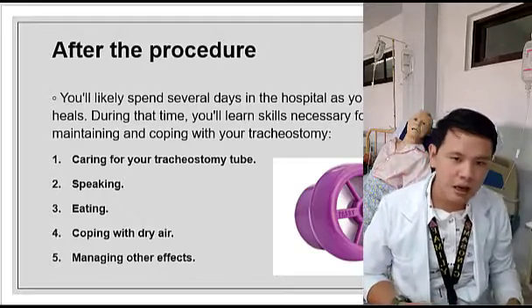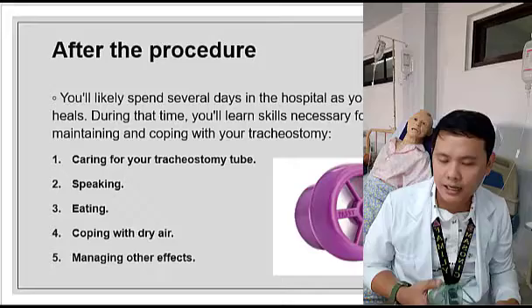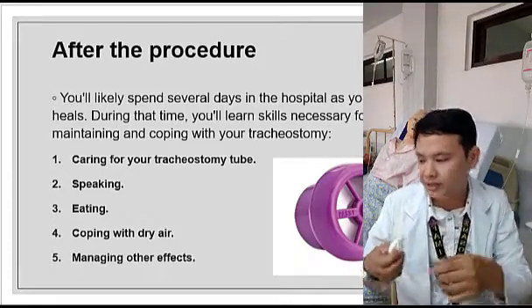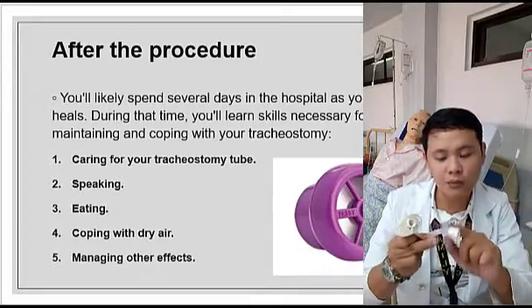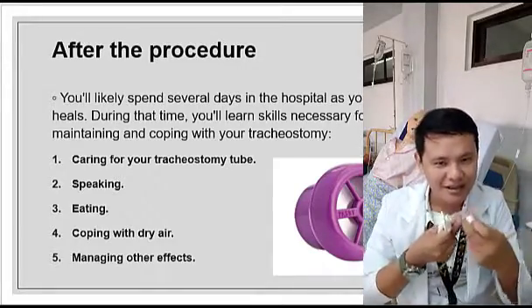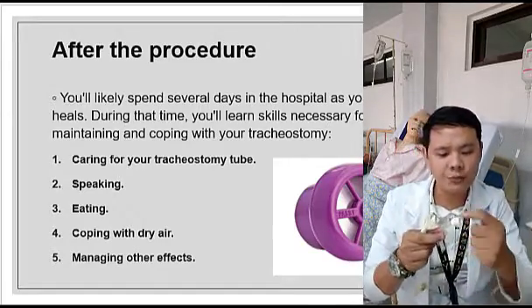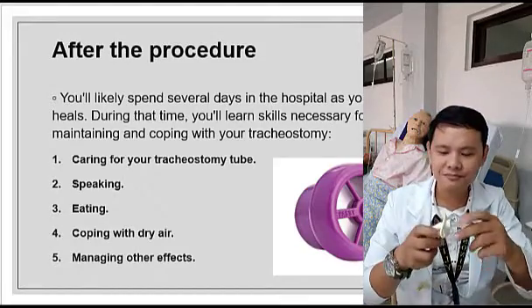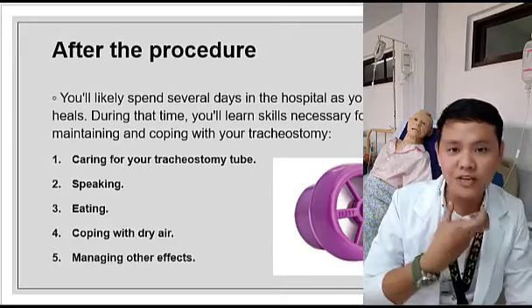You can also instruct the client na meron pong tracheostomy na pwede silang maglagay ng konting tubig sa may inner tube. Okay, they may add some water. Okay, wag directly po, baka pumunta sa may lungs, lalo na kung marami. Konting tubig lamang. Okay, we can instruct them to put some water there. Nang sa ganun, ay magkakaroon ng humidification doon sa may hangin niya.